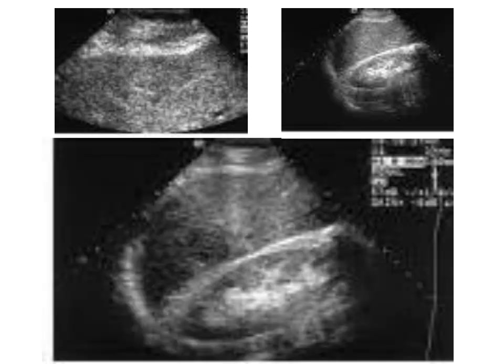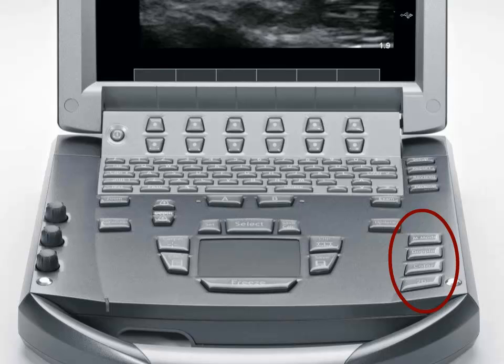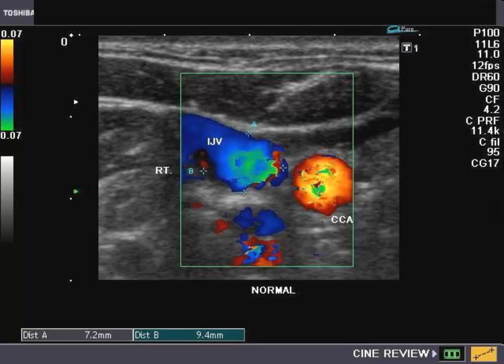Here, the top image is too shallow, and the top right image is too deep for the organs of interest, which is in the area between the liver and the kidney in this case. Now, if you need to find the colored Doppler or M mode buttons, they are usually located near the 2D button and are labeled so. To go back to standard imaging from any of the special modes, all you need to do is to push the 2D button again, and that will take you back.